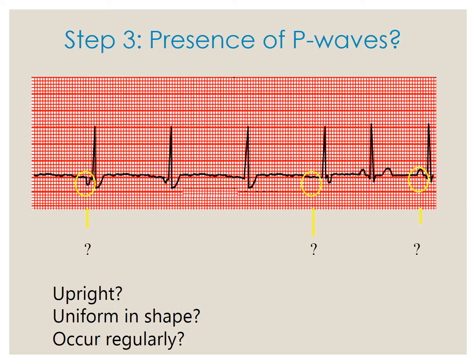And you can see on this strip there is quite a lot going on here, where it has one depressed P wave, then there's none, and then you see at the end it looks like a normal P wave on the last two.